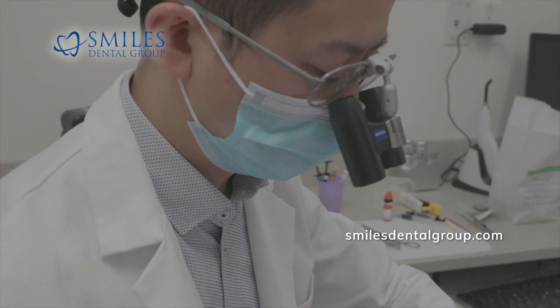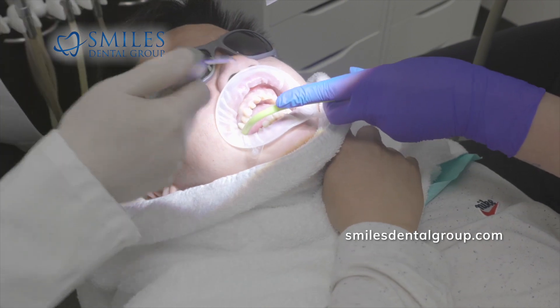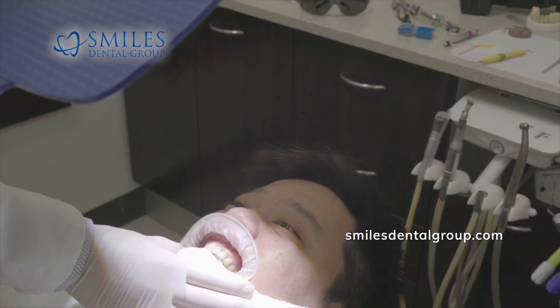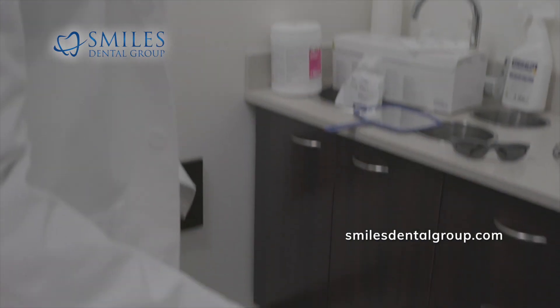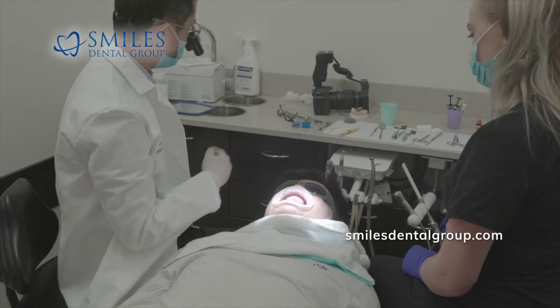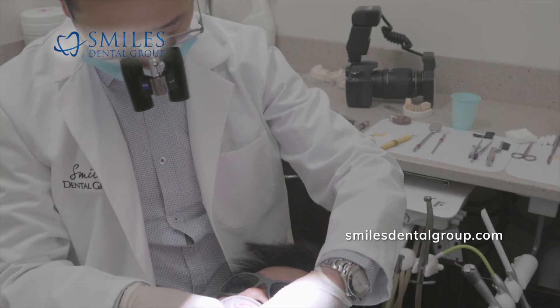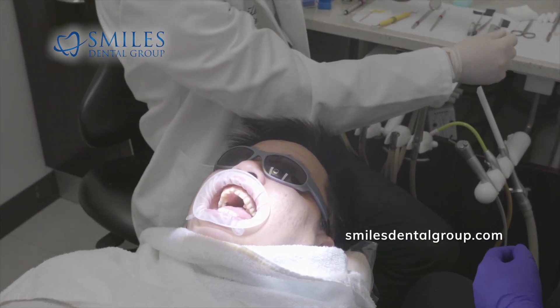We've removed all the temporary restorations and you can see the prepared teeth — the lateral and central incisors. We've already tried the porcelain restorations on, and you just saw Michael looking in the mirror giving a thumbs up, confirming he liked the results. I also like the results. If the patient likes the results but I don't, I still won't complete the case until it meets both of our standards. Sometimes patients miss something that I see, and we'll either fix that or have the case redone. In this case, everything looked really good.